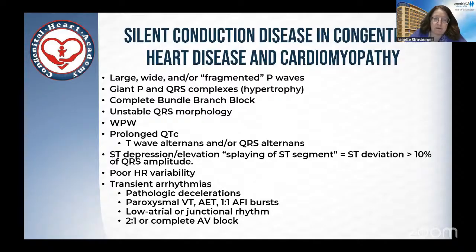We're looking for ST depression and elevation, and basically we measure this as a splaying from the baseline of the end of the QRS. And we sort of have arbitrarily said that if it's more than 10% of the total QRS amplitude, it's probably significant. And we look for heart rate variability.